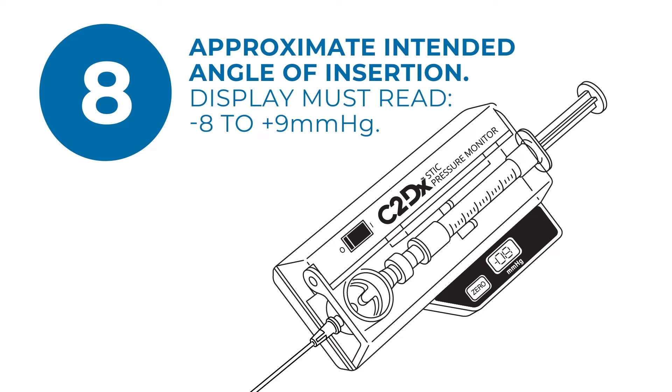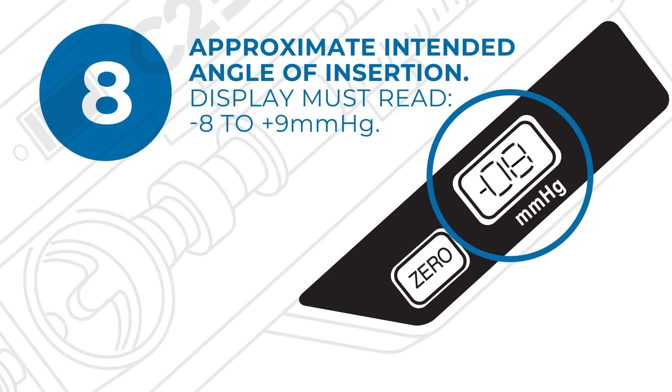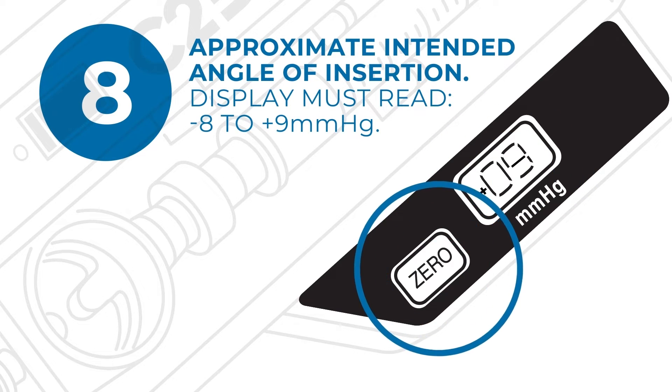Now approximate the angle in which you intend to insert the needle into the skin. To ensure accuracy, the display must read negative 8 to positive 9 millimeters of mercury before pressing 0. When the display is in the correct range, press the 0 button and wait 2 seconds until the display reads 00.